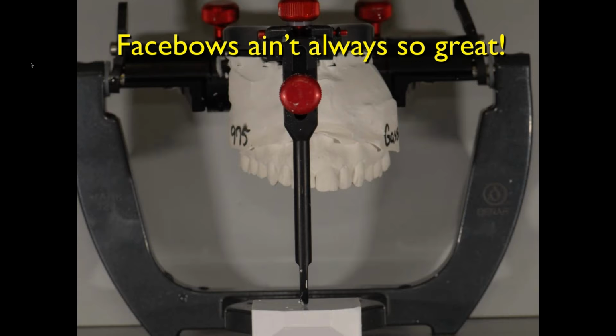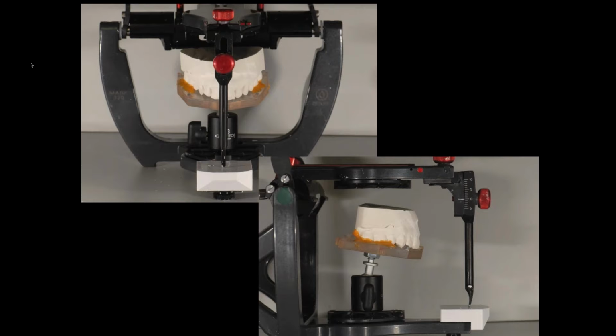Okay, and sometimes face bows, they're not as easy as you think, and they're not always so great. They can easily be off. They can get moved in the mail. They can get taken improperly by the doctor. A lot can go wrong with face bows, whereas with an occlusal stand, and this one here you see was our first prototype when we didn't have one that was actually made for the articulator. That has since changed. This is an old picture, but shows kind of where we started with this whole idea.